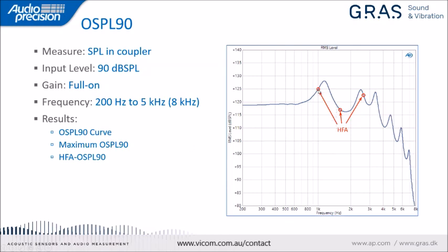three specified frequencies. Those are 1.0, 1.6, and 2.5 kilohertz. We take the level or gain at those three frequencies, simply average the decibel values, and that's called the HFA gain or the HFA level for high frequency average.